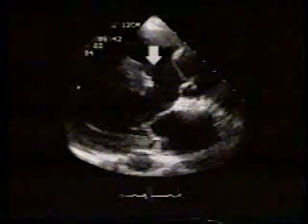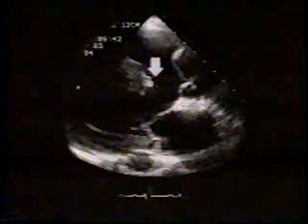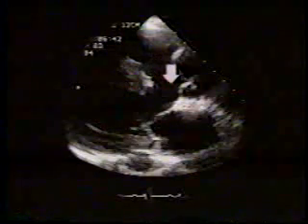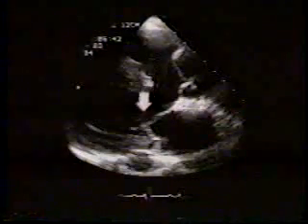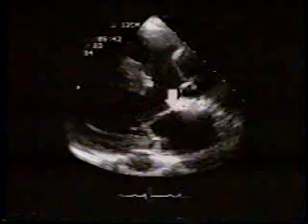This is the long axis view of a patient with pulmonary atresia and large ventricular septal defect. The features are again similar to patients with tetralogy of Fallot, a dilated aorta overriding the plane of ventricular septum and normal mitral to aortic continuity. In real time, note that this patient has abnormal aortic valve with systolic doming.